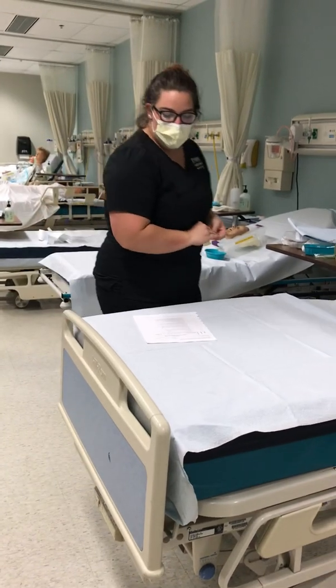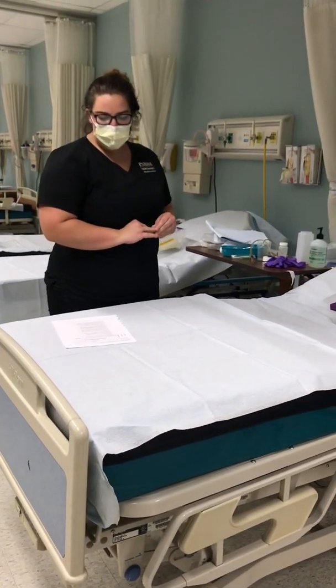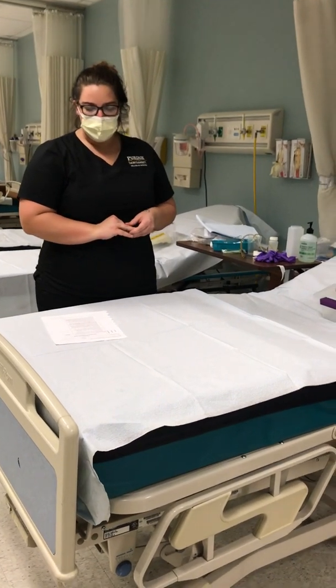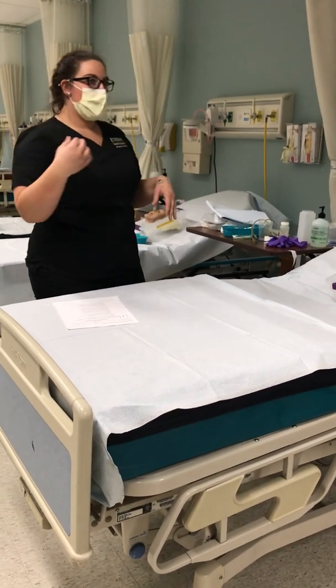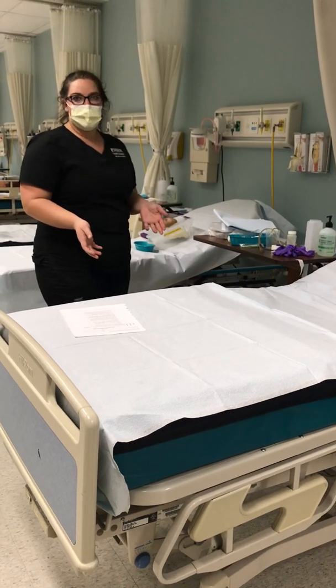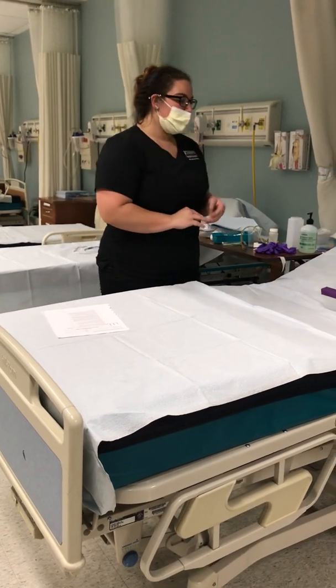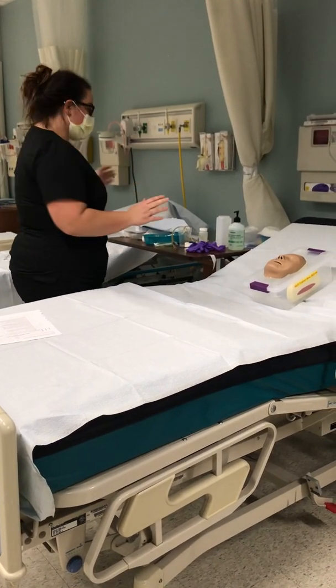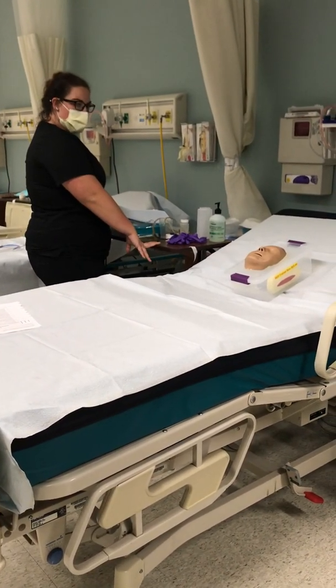Okay, so for NG tube insertion, I will check the patient's medical records and gather all my supplies. I will perform hand hygiene and put on any PPE that's indicated, and then I will go into the patient's room, identify the patient, make sure I have the right one, and then I will assemble all my equipment, which I have done here already.